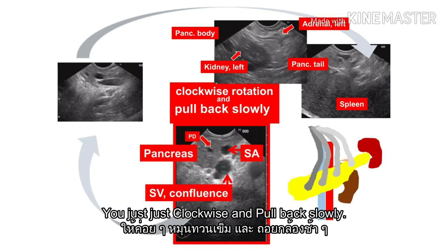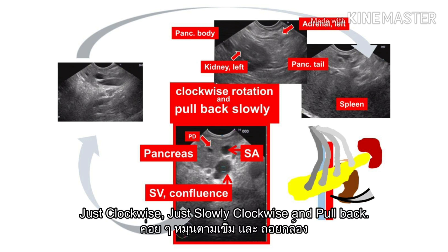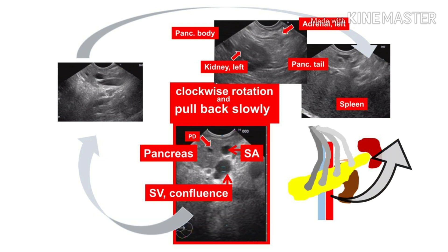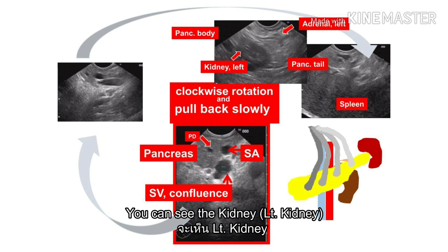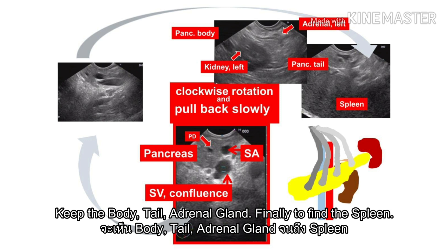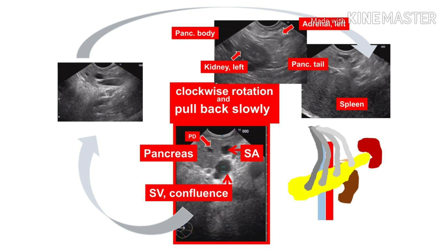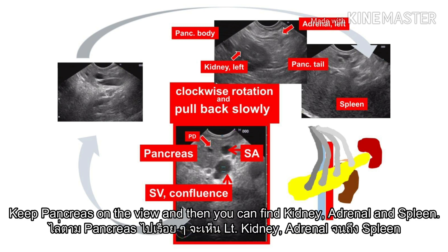When you find the pancreas, just clockwise and pull back slowly — from the genu, to the body, and to the tail of the pancreas. Just slowly clockwise and pull back. You can see the kidney — the left kidney. Keep scanning the body and tail. The adrenal gland. Finally, find the spleen. See the genu, slowly clockwise and pull back. Keep the pancreas in view. And then you can find the kidney and spleen.